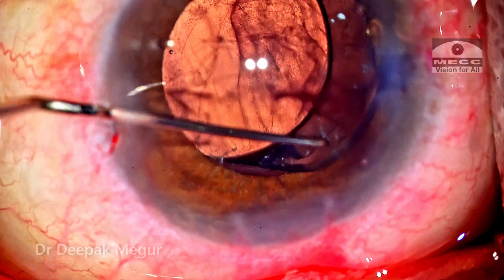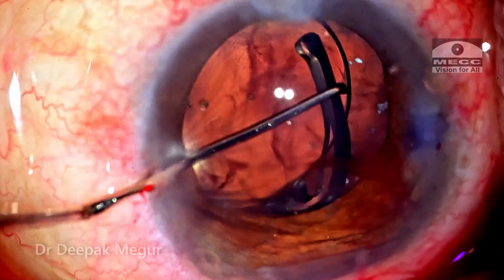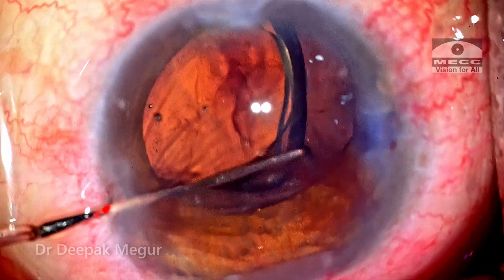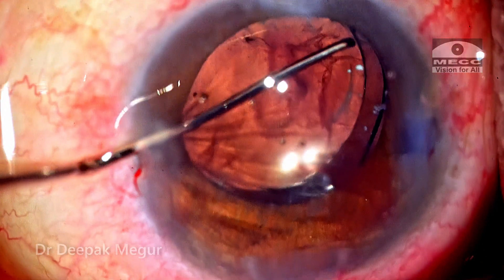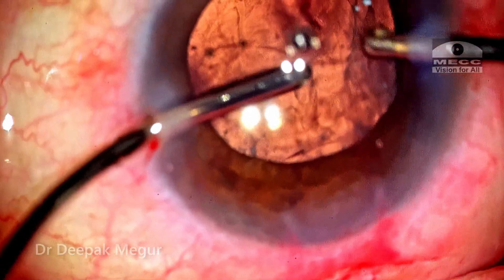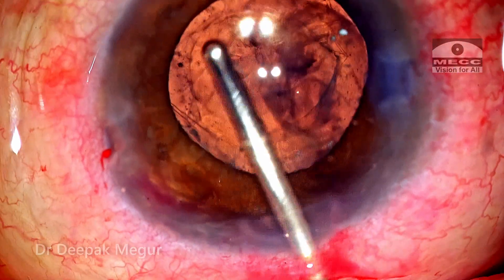The proximal haptic is then gently maneuvered into the bag. In these situations when the bag is loose and we have a soft eye, it's difficult to dial the lens in. A technique I found useful is using the Sinski hook to fold the haptic and introduce it under the anterior capsule. It's then time to remove some of the OVD and blood which has entered into the anterior chamber and also some of it that has gone behind the lens.